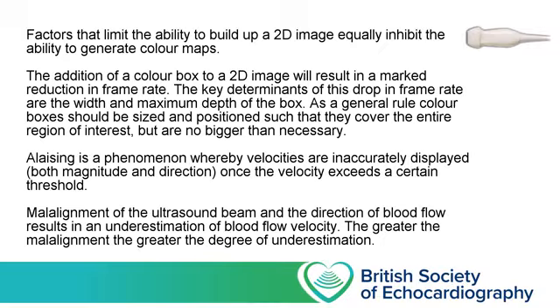Thirdly, when using pulse Doppler, there's a maximum velocity that can be accurately displayed, and even in healthy patients, the velocity of blood as it moves through the heart will frequently exceed this limit. Aliasing will occur and you'll need to recognise this. And finally, the difference between the direction of blood flow and the direction of your ultrasound beam will have an impact on how much the true velocity is underestimated.